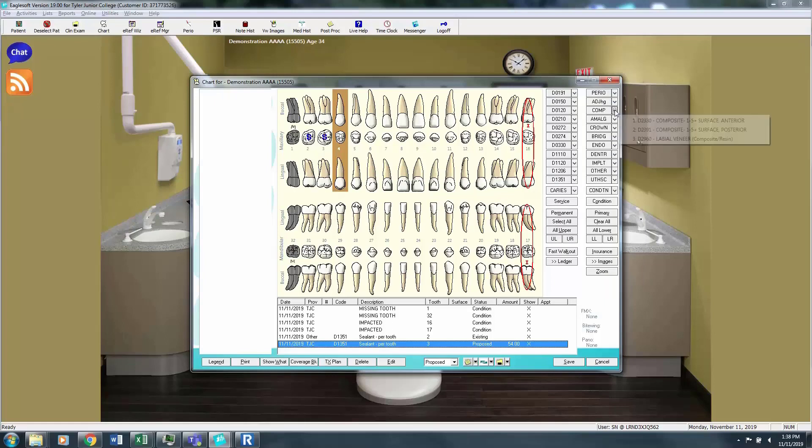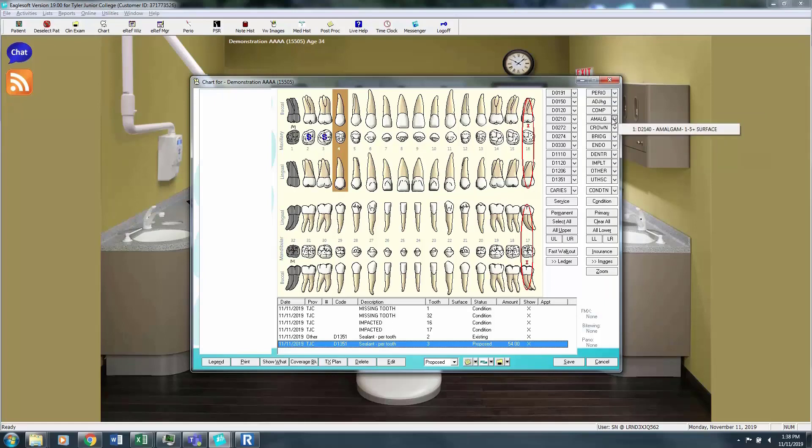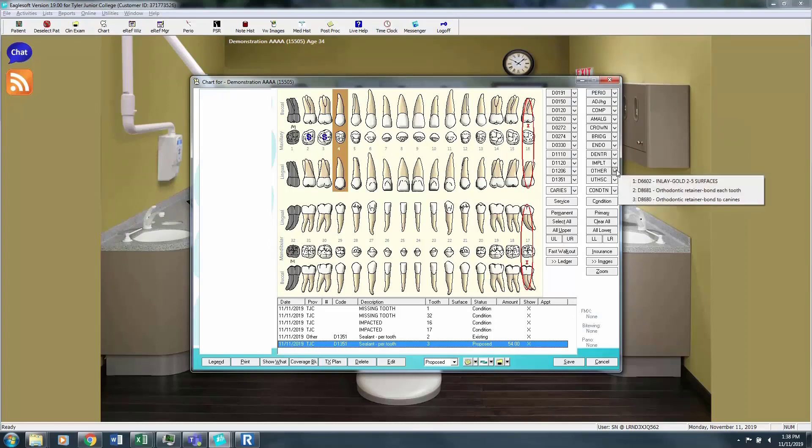Along this side we have our composite fillings, amalgam, crown, bridge, endo, dentures, implant, and other. Other is where you'll find the gold inlays and where you will find the retainers. The retainers are very, very common to see on patients.